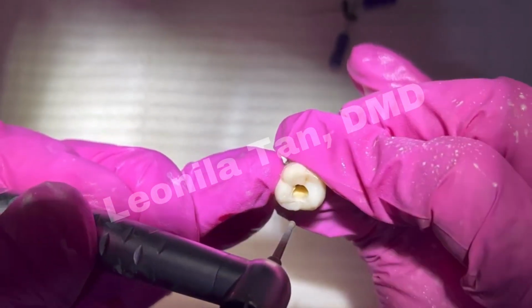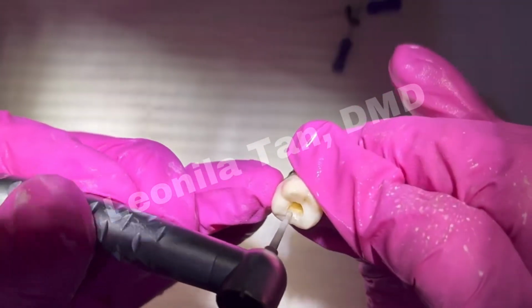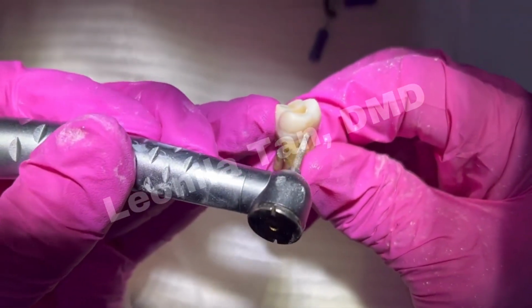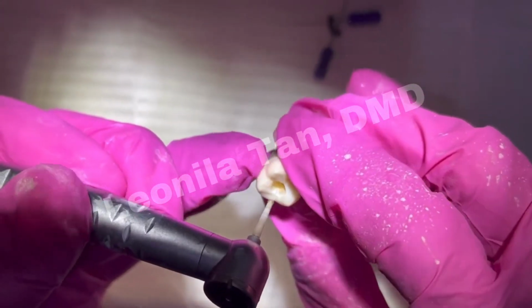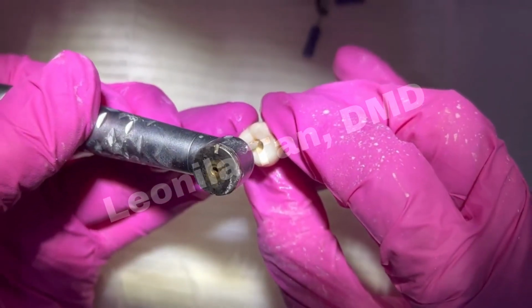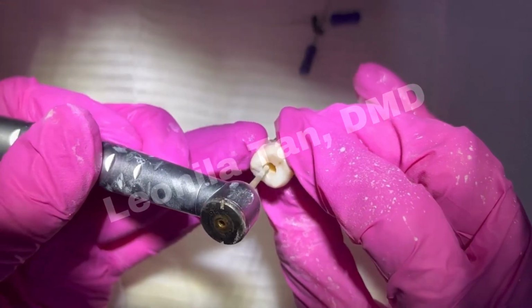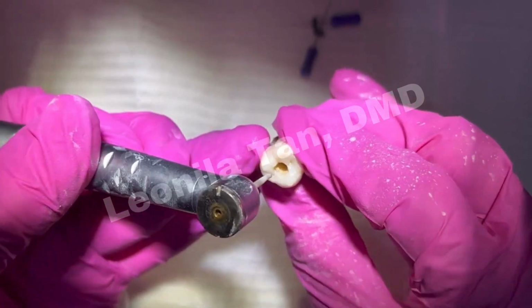can be diverged, but notice the marginal ridge remains intact. You want to diverge that also because notice your anatomy. Okay, you don't make parallel walls. That's diverged. So aside from convenience, you're able to properly unroof, you maintain the thickness of your mesial wall. Okay, notice my burr is just slightly creating that flare or diverged wall.